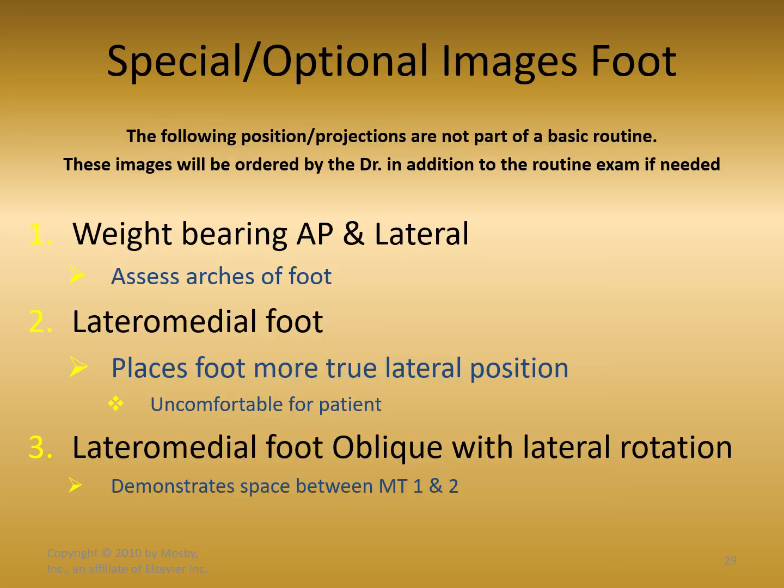The following three positions that we're going to look at now are special optional images of the foot. They are not routines. So if you have a person that comes in with a prescription that says right foot, you will not be doing these unless they are ordered specifically as an extra order added onto the routine positions.